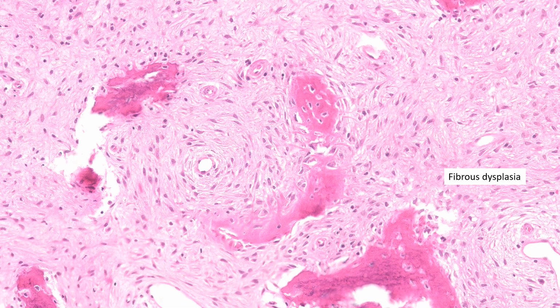Again, notice that there isn't much of an osteoblastic rimming. A feature that you'll often see in fibrous dysplasia is fairly well described here. These fibers connect the connective tissue of the lesion to the bone. Do you see these things? These are referred to as Sharpey's fibers, and they are fairly typical of fibrous dysplasia as well.